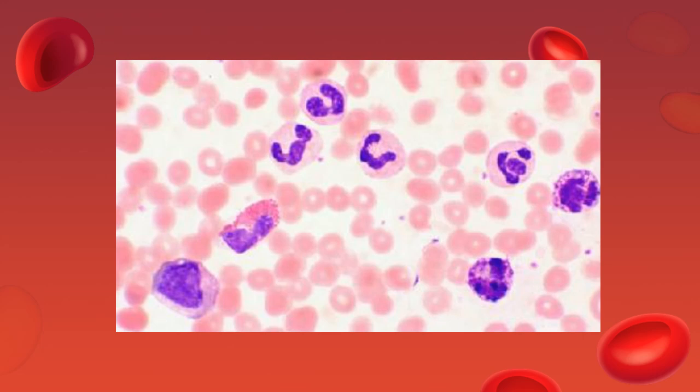Okay. So, what is the procedure for differential counting? We count 100 WBCs while differentiating them. For example, this one: monocyte, eosinophil, neutrophil, neutrophil, neutrophil, neutrophil. This one is basophil, basophil. And then in the total count, 1, 2, 3, 4, 5, 6, 7, 8. We count while differentiating them until we reach 100 WBCs.